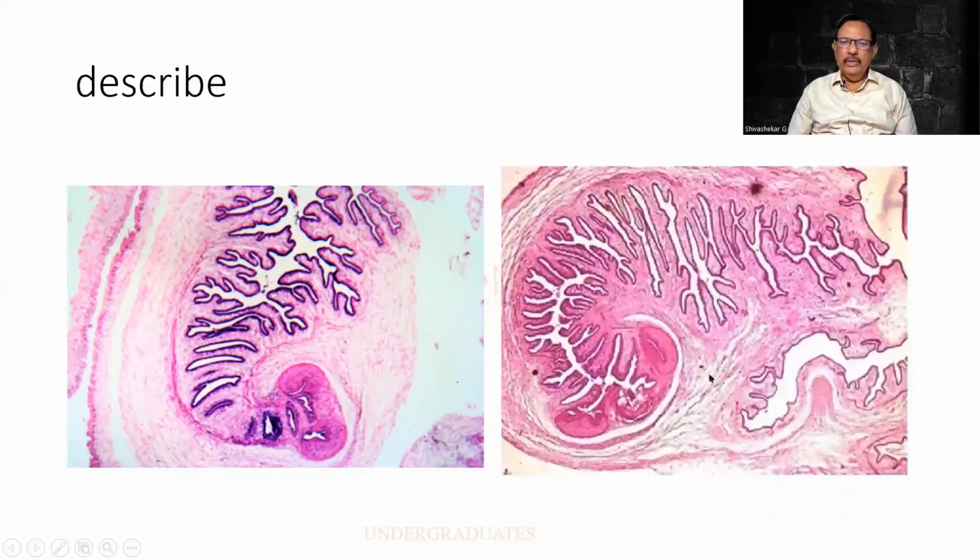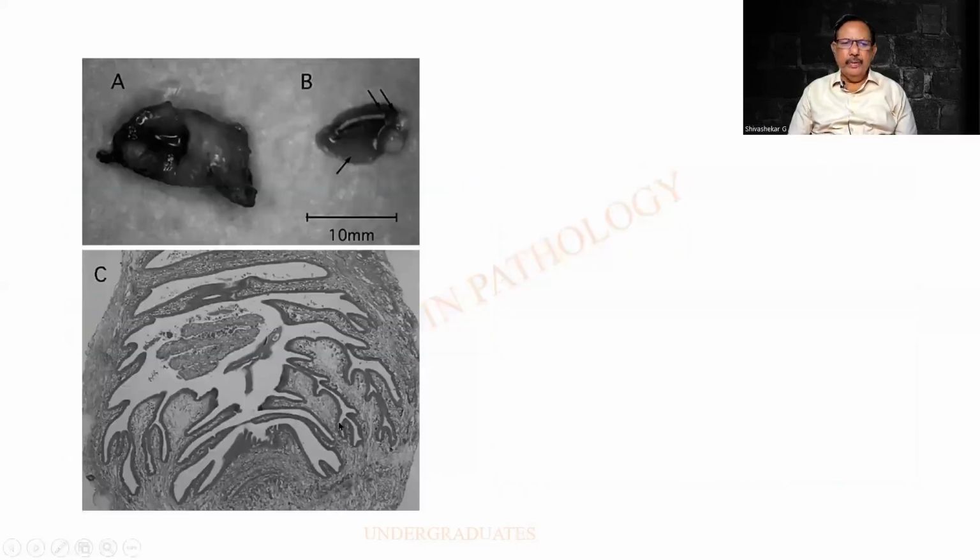So this is again the same. This is the head of the scolex that is developing. So I'm finding particularly the lower part, it will be having this leaf-like configuration or a holy leaf pattern. Look at this beautiful picture of it. A holy leaf-like pattern is there, and this is the gross picture of a cyst that has been removed.